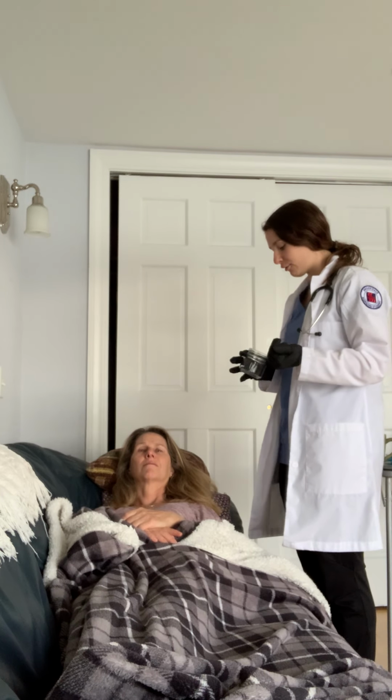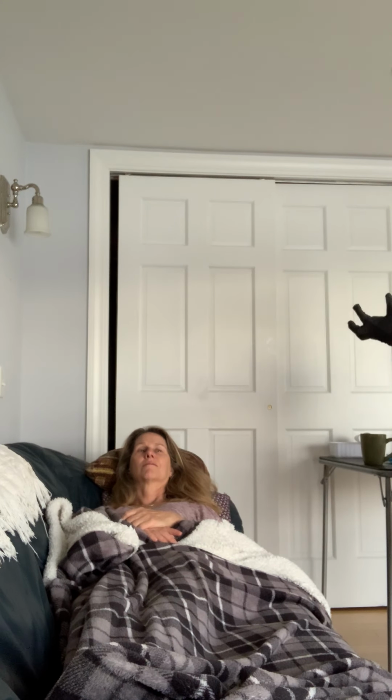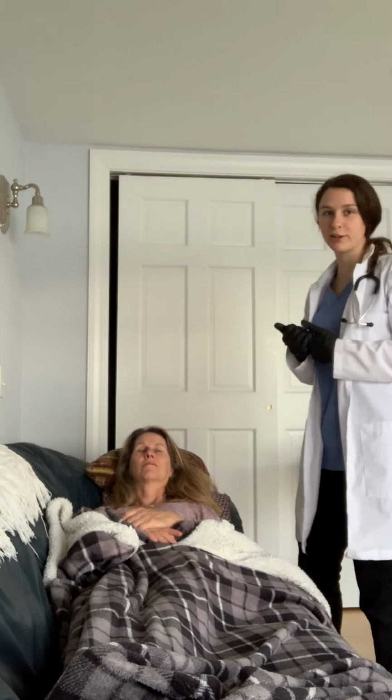So I want to look at the health record. I would want to look at the health record to see whether it's a gastrostomy tube or a jejunostomy tube, because with the jejunostomy tube you wouldn't aspirate because it's not in the stomach, so it's not in a reservoir that would have gastric contents sitting in it. But since she has an NG tube, that is why I aspirated.